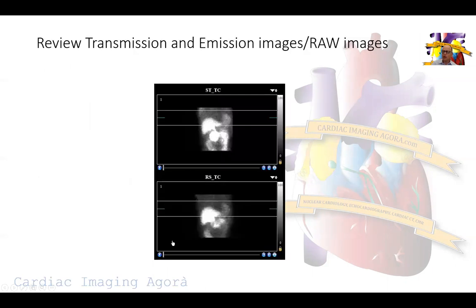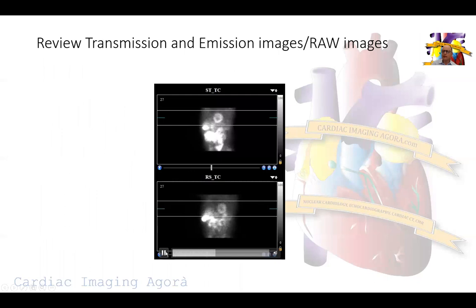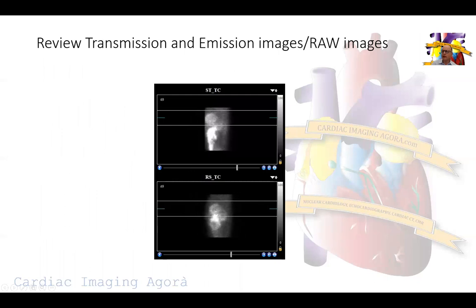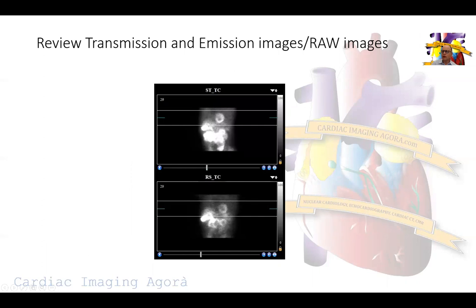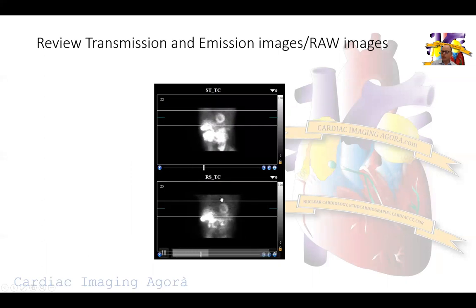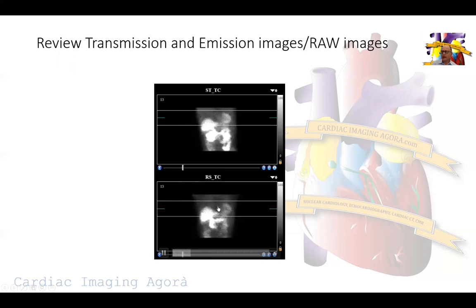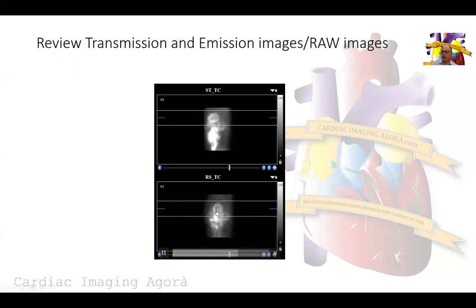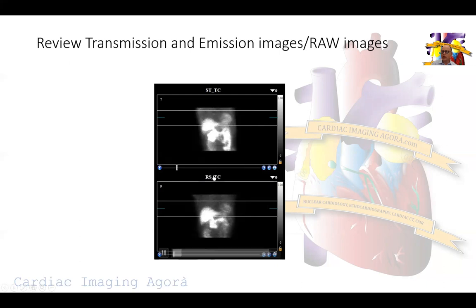On a SPECT study, we always start with the raw images to review the patient's heart position, motion, extra-cardiac activity, attenuation, and diaphragm or breast attenuation.